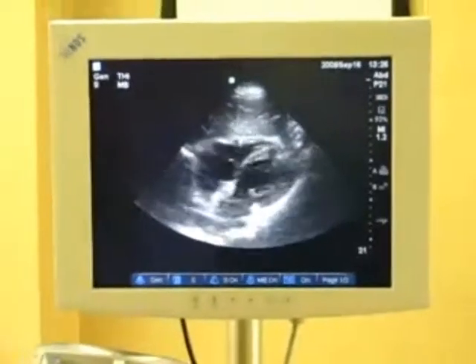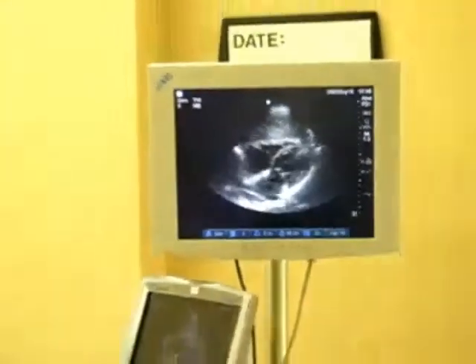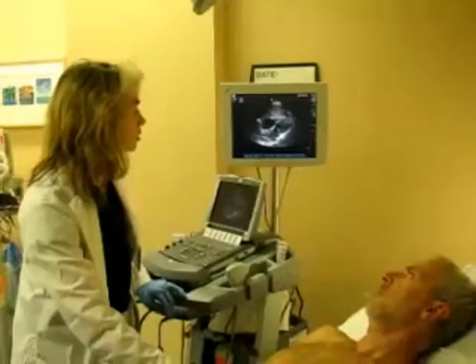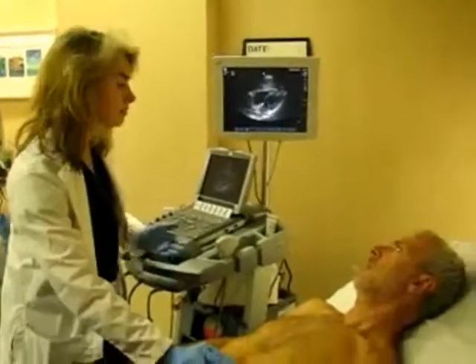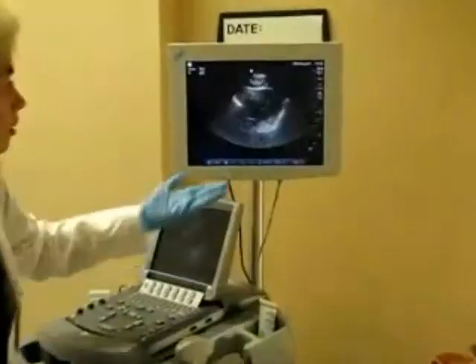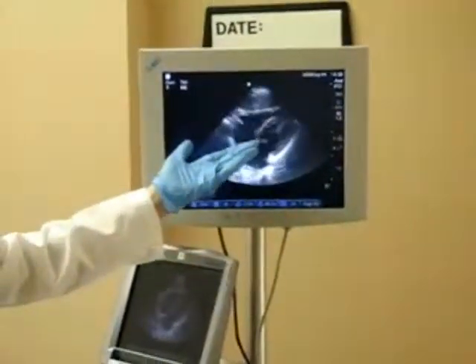In order to improve the visualization of the posterior wall of the heart, you can ask the patient to take a breath in, which moves things anteriorly.